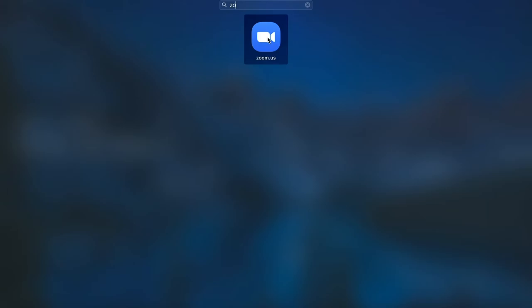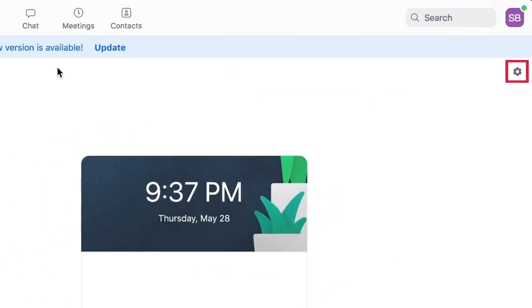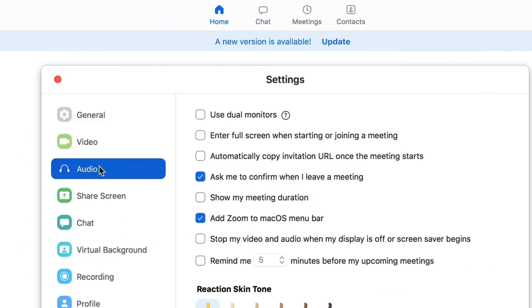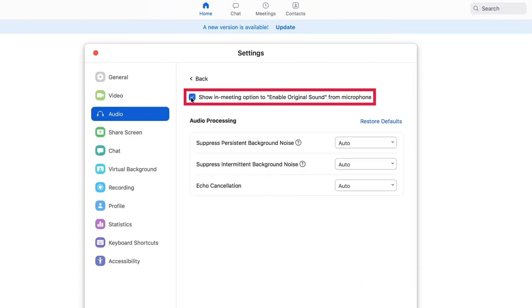Zoom settings. Before you begin your telehealth session, open zoom on your computer. Go to settings, audio. Click on the advanced settings and check the box next to show in meeting option to enable original sound from microphone.